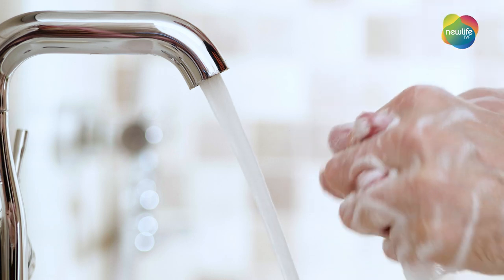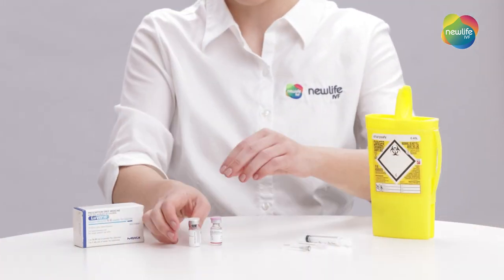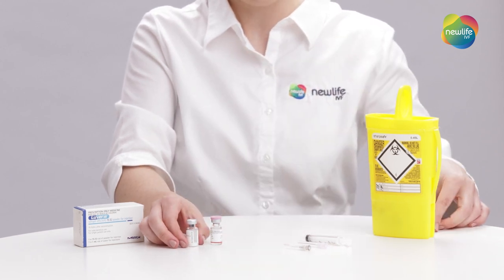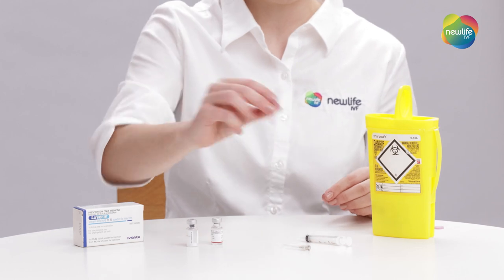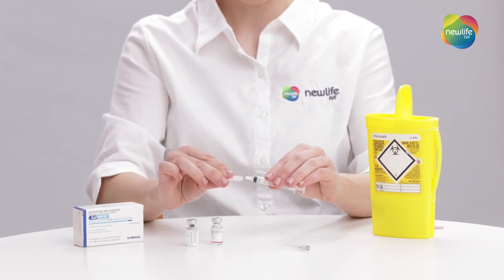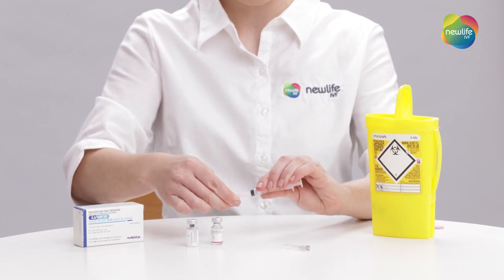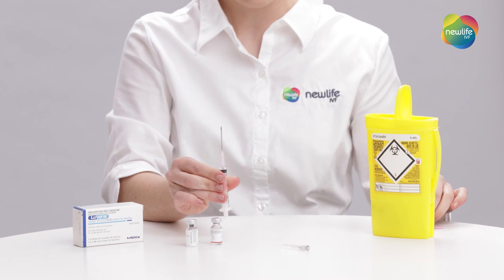Wash your hands with warm soapy water and dry thoroughly. Next, remove the cap from the Levaris vial and the water vial for mixing. Remove the larger needle and syringe from their wrapping and attach the needle onto your syringe by twisting it on. Then remove your needle cap.